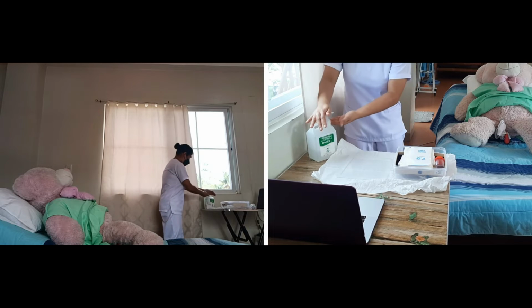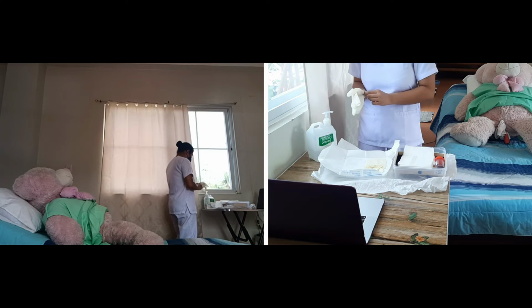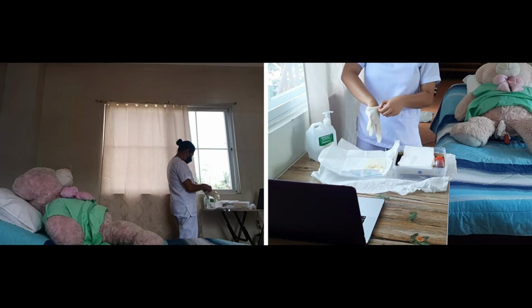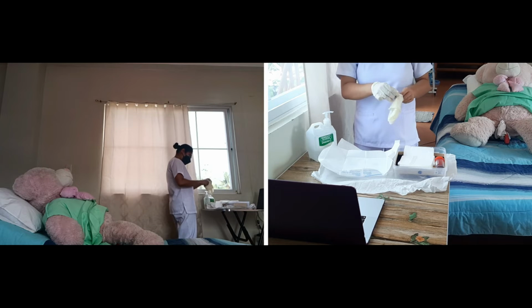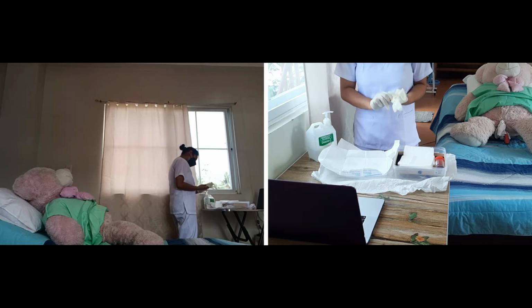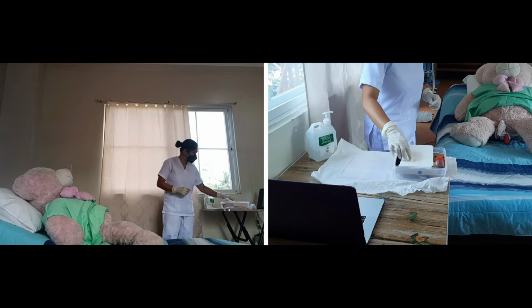So now let's put on our gloves. Okay, so this is the drape.